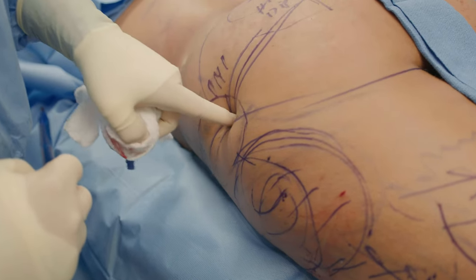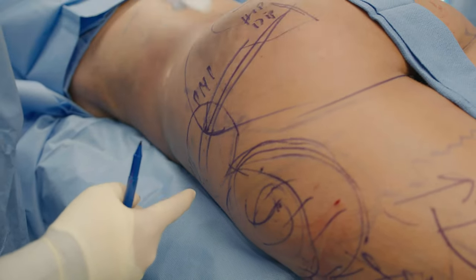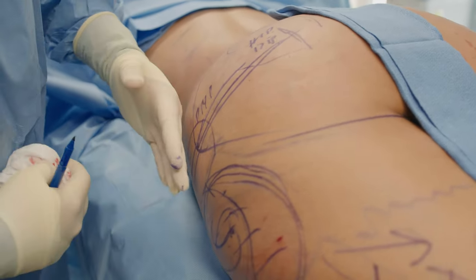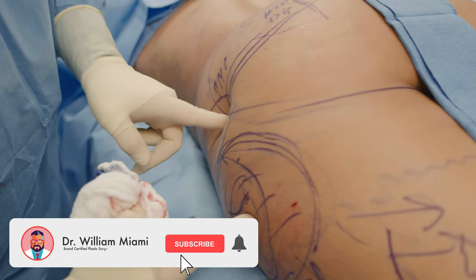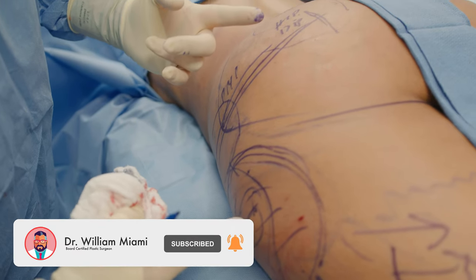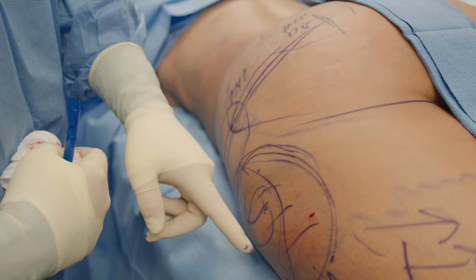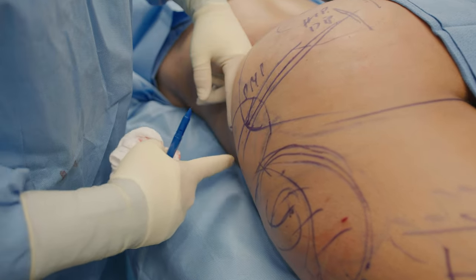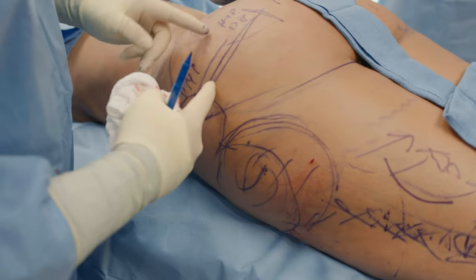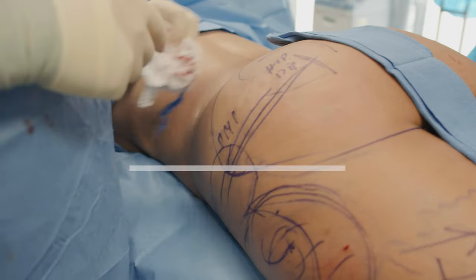Remember I want this to be the point of maximal projection. She's nice and soft so that's great, and I know from her other side that that tissue is going to expand. So I'm going to put fat in here because I want this part to be higher than this part. I want this to project more than this, and on the other side I was able to get a really nice front hip, so for sure on this side I'll be able to do the same. Then I'm going to blend that all the way in here and make sure that line is good, and then I'm going to blend back into the gluteal area to give her more volume and projection here. So that's the plan, let's do it.